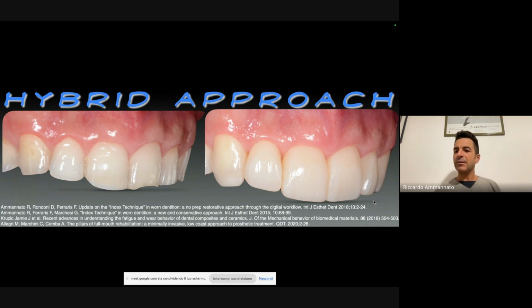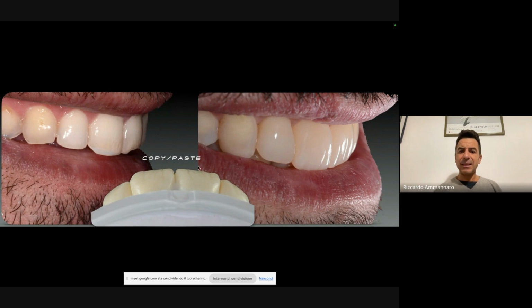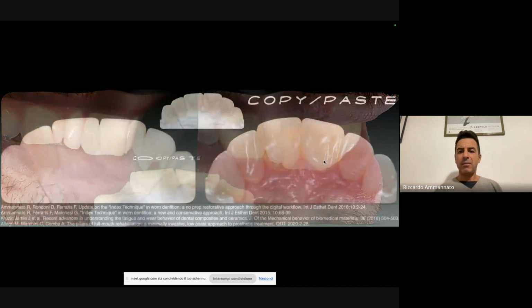So from lateral to lateral, again, this molding approach through the index technique, no prep situation, while a short bevel, the fine 45 degrees, for the canines that has the tip in glass ceramic, and all it's wrapping up also on the palatal side, in order to have the new static and then the new dynamic through the canine guidance. We see here some details concerning not only the shape, the copy paste of the shape, but also the copy paste of the texture, which is also very, very important.